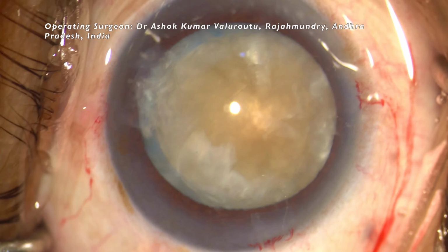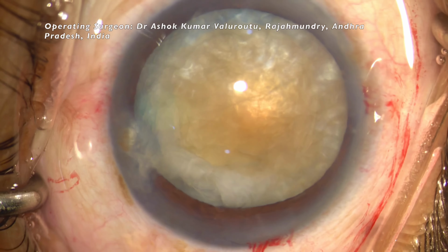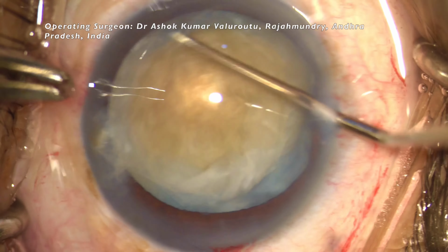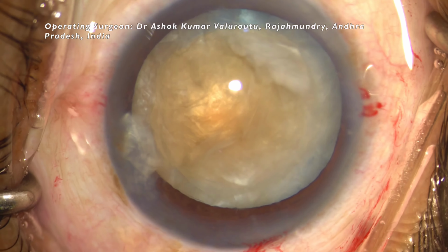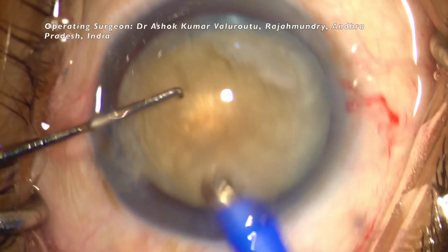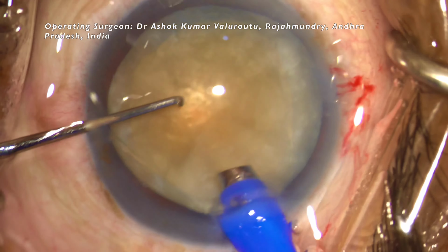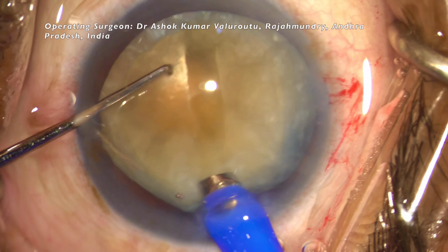Now once the CCC is done, the main incision is made, and now the hydrodelineation or hydrodissection is done. In this case, the hydrodelineation or hydrodissection can't be seen because of the hypermature nature of the cataract. Now the phaco probe is inserted.